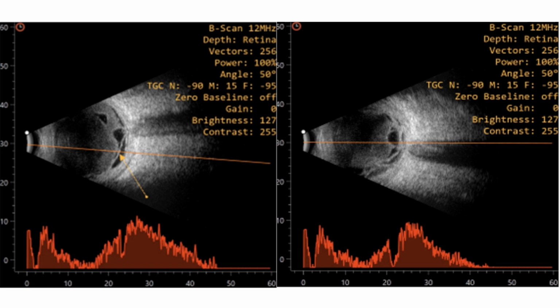So both the things. Actually, there was poor response also, and the vitreous cavity shows a lot of dot echoes as well. So maybe the only intravitreal medication won't suffice for the treatment, and debridement of the infected material. That is one. Non-response or poor response would be an indication to go for surgery.